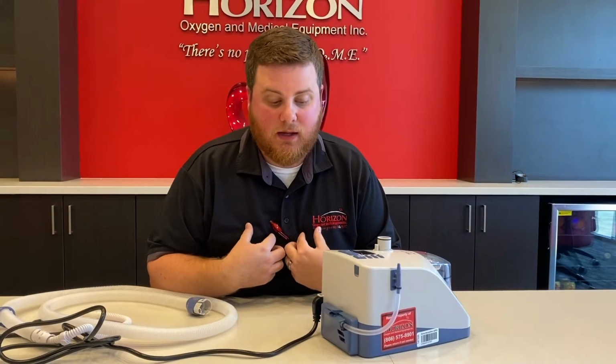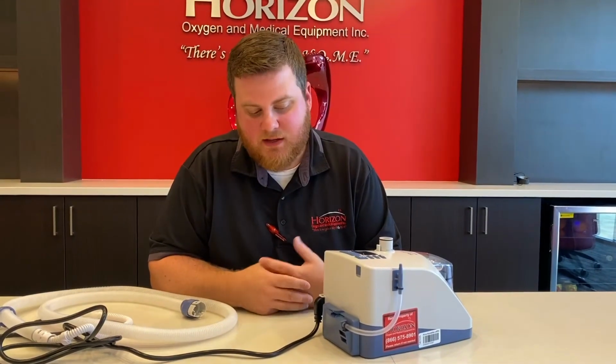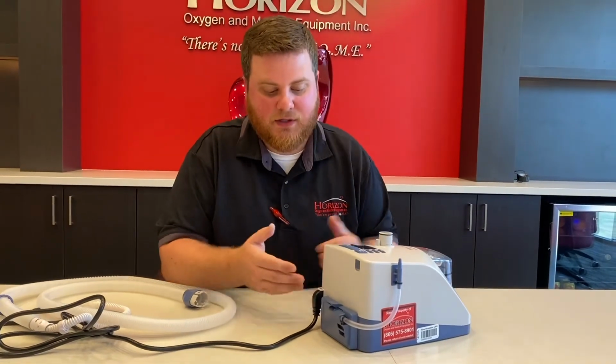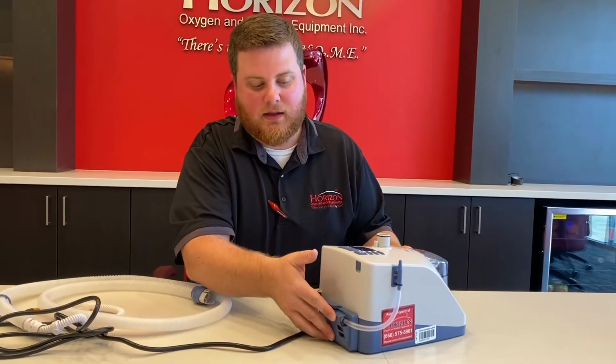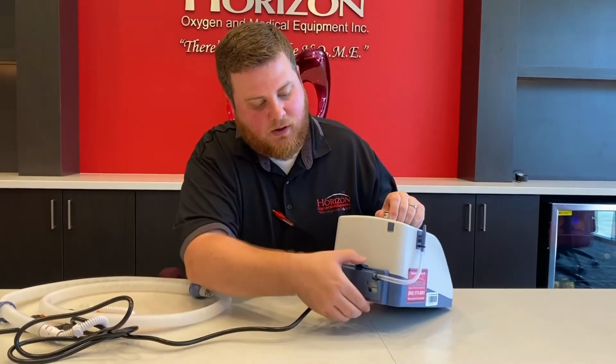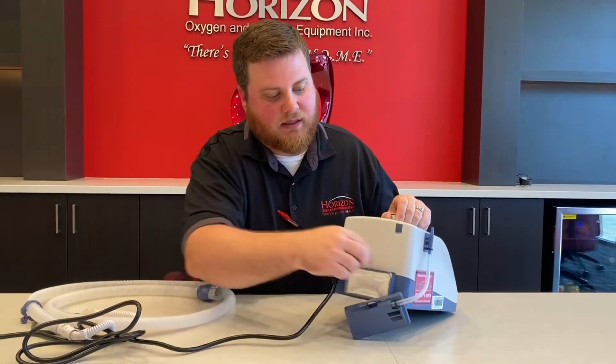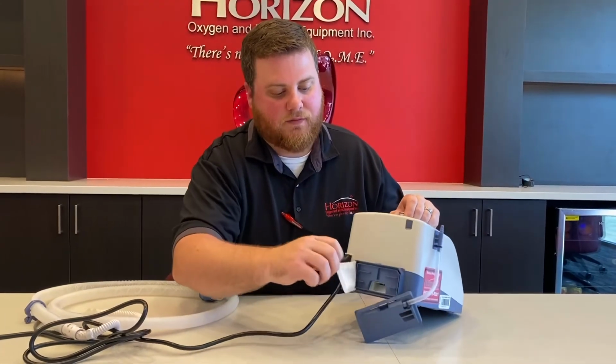You shouldn't have to access this because this is something that we're gonna take responsibility for, but there is a filter in the back of the machine. Something that does happen occasionally is people actually snag this part of the filter. So on the back, you'll see that if you just pinch down this little lever here, we can access that filter. And the filter looks just like this, and you can actually peel this off.